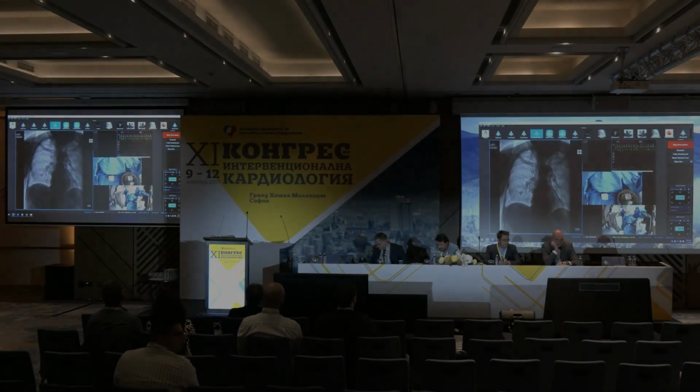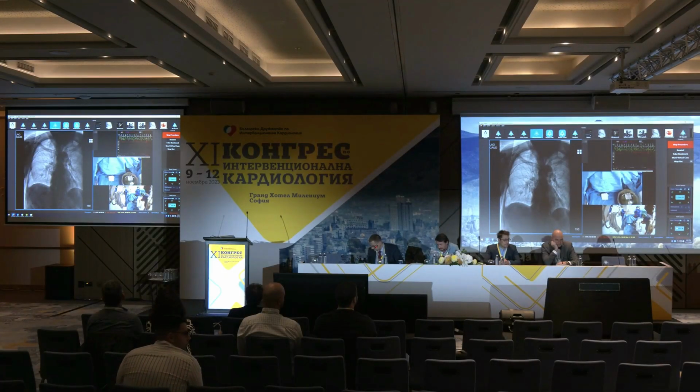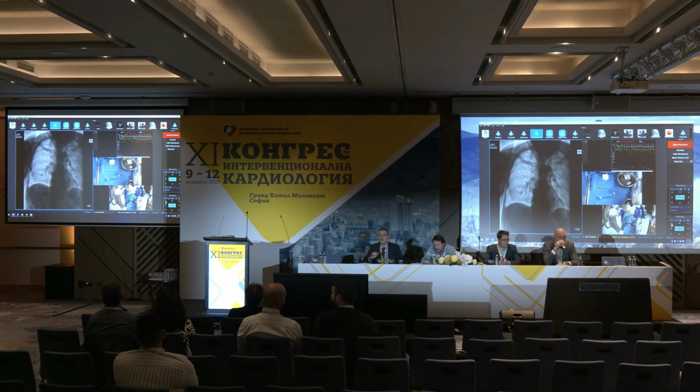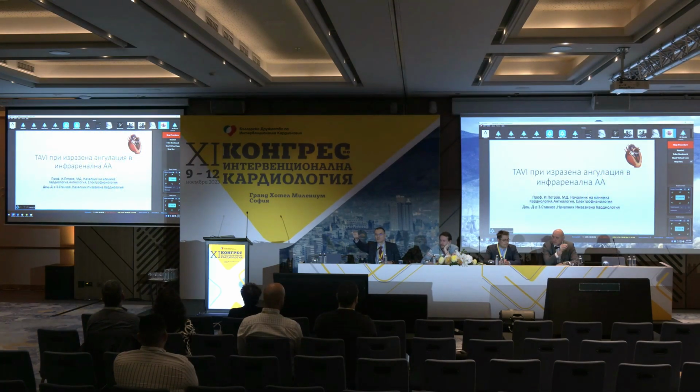Okay, we are going to do an interesting case of a huge tortuosity of the abdominal aorta, the TAVI case, probably by axillary approach. And I will ask Dr. Kuzov now to present the case. Please, Dr. Kuzov.